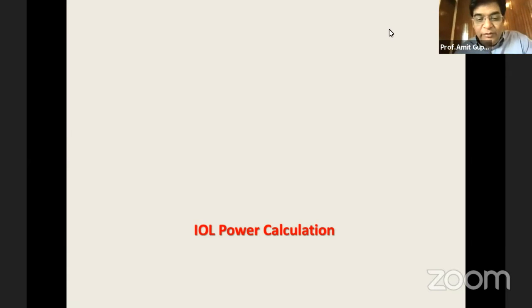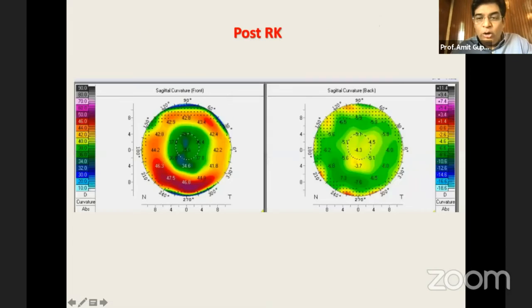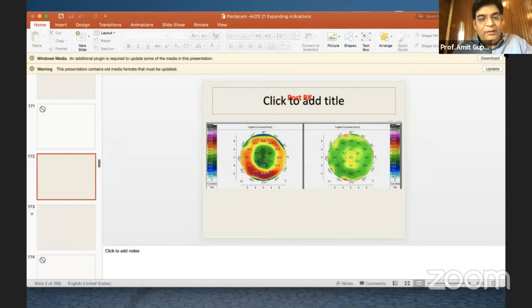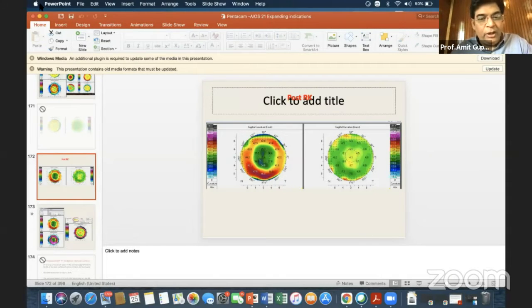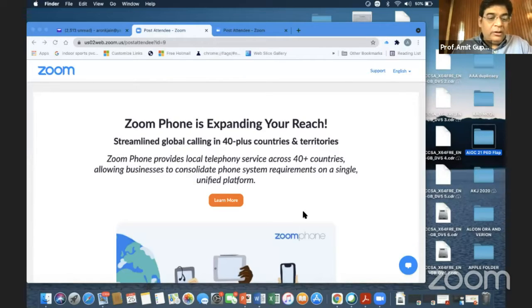Thank you, sir. It was a very vast topic, and I think you've addressed it in an excellent way. These are very practical tips for everybody. And as Dr. Michael Belin says, just like in glaucoma, we don't just look at the disc, or just the fields, or just the IOP. We have to look at all three of them together. And probably with many of these Pentacam parameters, it would be a good idea to consider all these things together, so that we are able to reach a logical conclusion about whether the patient has keratoconus or what we are screening the patient for. Thank you, sir.